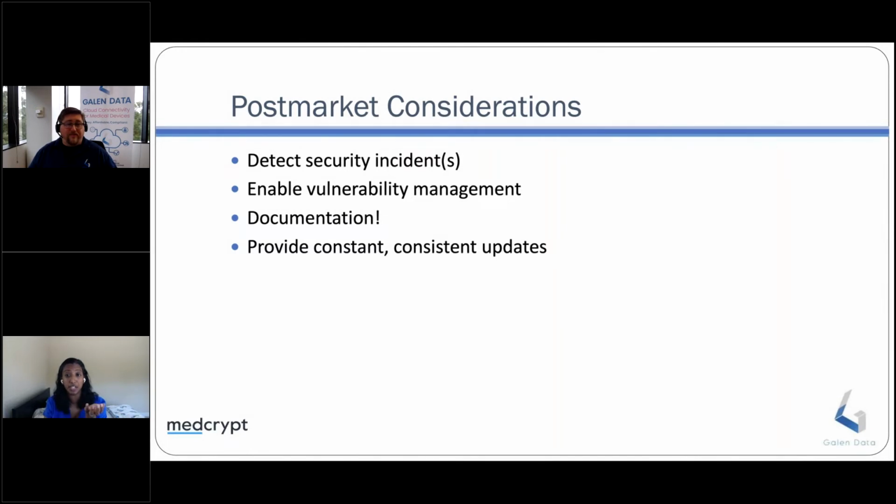And I think it used to be really idiosyncratic. It was, I'm going to target this singular device, this single component, this one thing. Now it's, hey, let me just go for the broadest reach possible and go as low level, far up the supply chain as I possibly can to impact not just healthcare, but pick your industry, right? There's a new one, it feels like every 10 days, and we're all kind of scrambling to figure out what to do next. So it makes sense that vulnerability management has a huge footprint here.